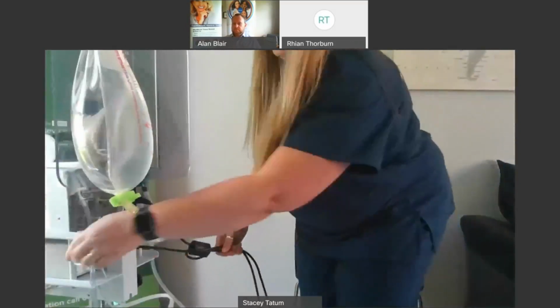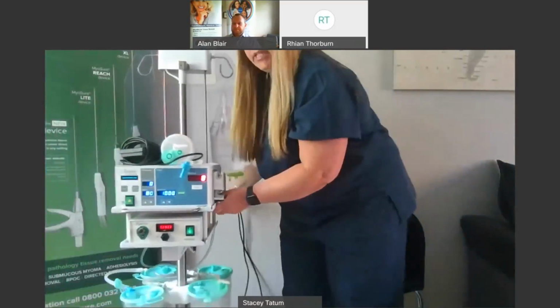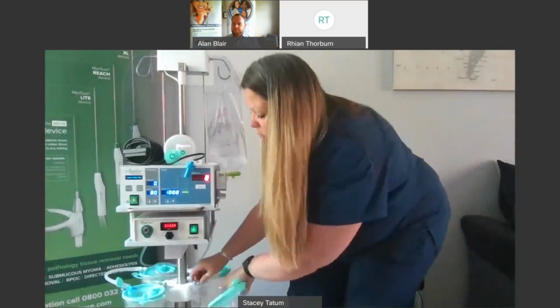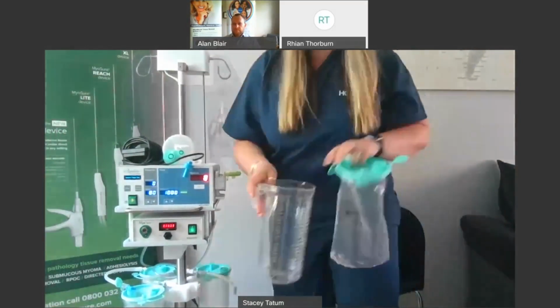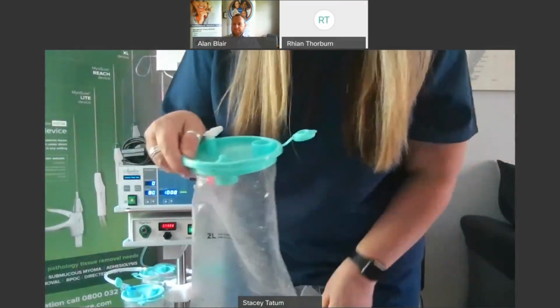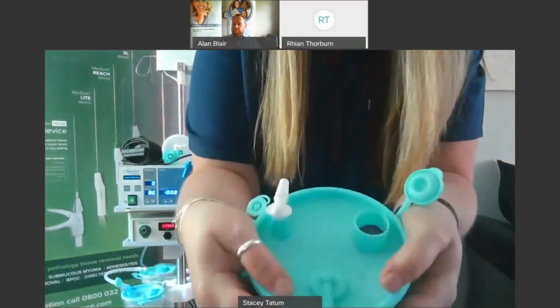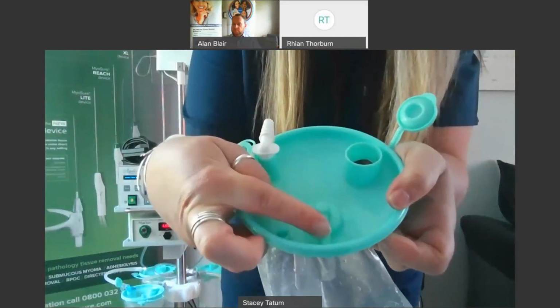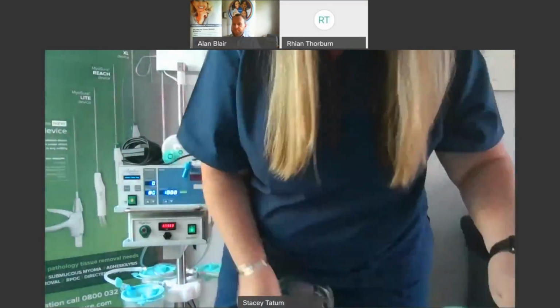So once I checked the back, I would bring it around and check my canisters. So I'm using Ceres at the moment on this system. I will go into VACSAC for you in a second. But each Ceres liner has a hole in it, and that is indicated by the end of this lollipop here. So there's the hole, there's the end of the lollipop.